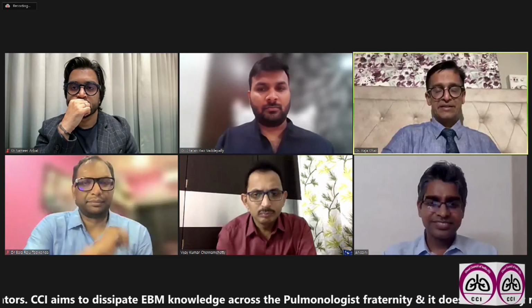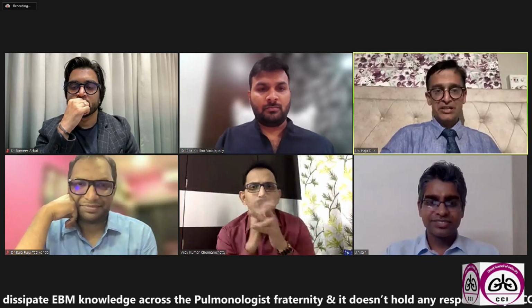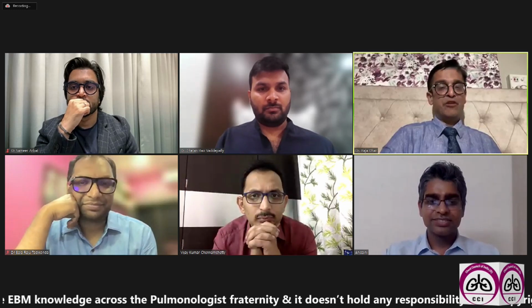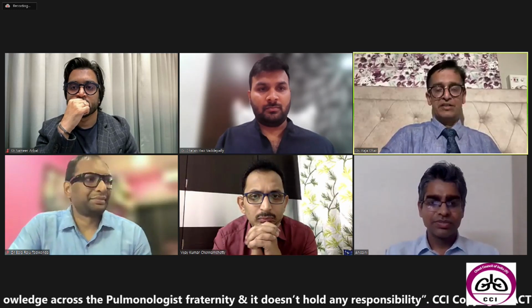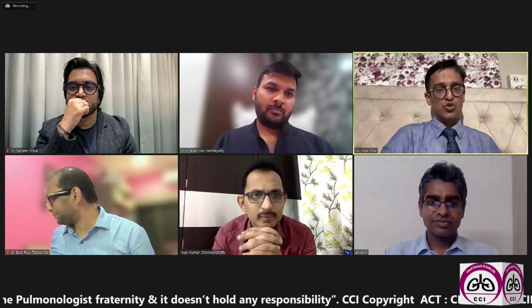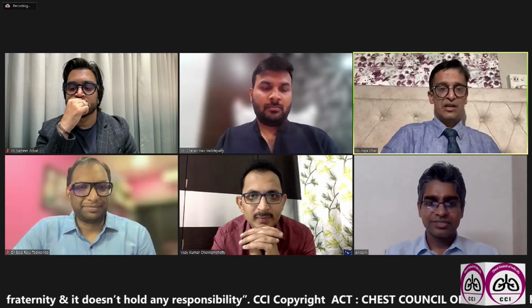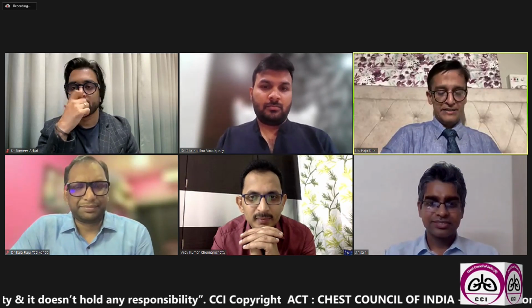Thanks. I completely agree with you. I think that's the message: it does give you more tissue, but probably doesn't change the diagnostic yield. But if we are doing it with the suspicion of malignancy, for example, for molecular analysis and immunohistochemistry, the extra tissue comes in handy. Using it in those scenarios probably makes some sense. We'll probably have to wait for further data.